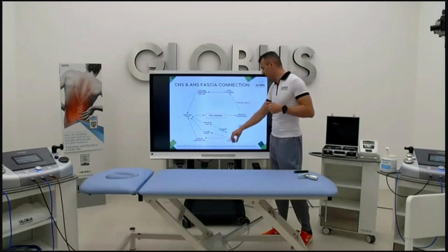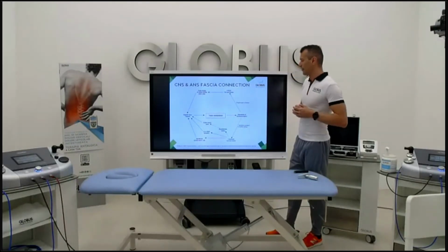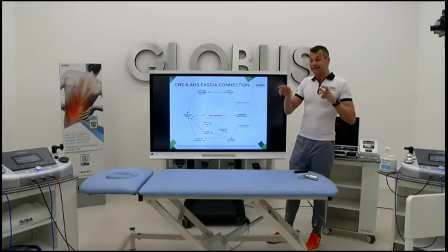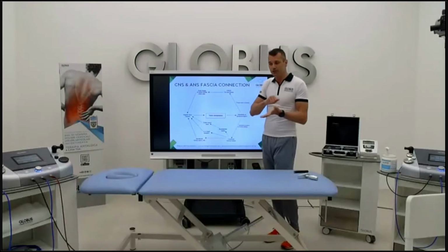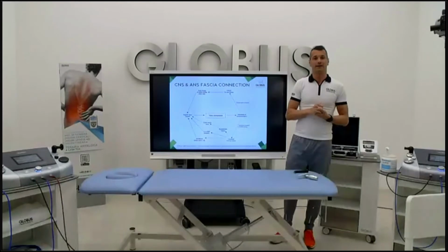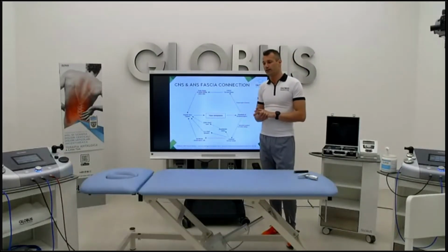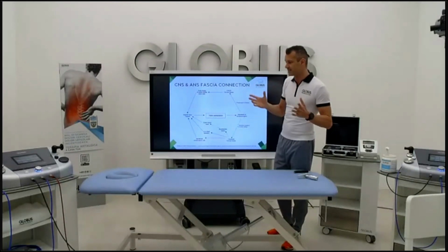On the other hand, we got another way through the autonomic nervous system, and we are going to have modification of the local fluids, for example, or we are going to stimulate also the hypothalamic activities. That's one of the reasons why in ancient Chinese medicine they used to scrape the tissues for promoting some healing processes on the human body. So we are really talking about something that now is proven. I really love this kind of techniques because they give us extraordinary results.